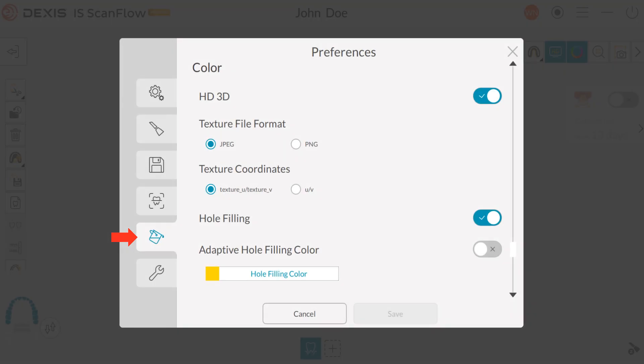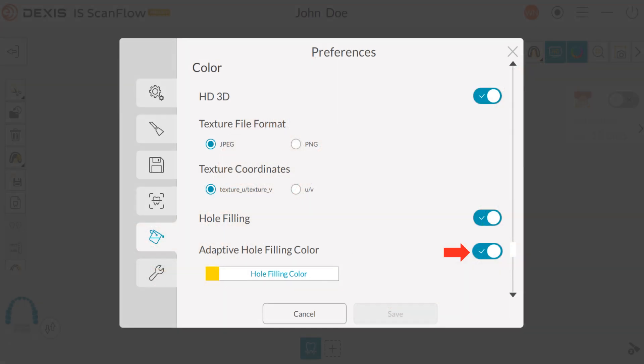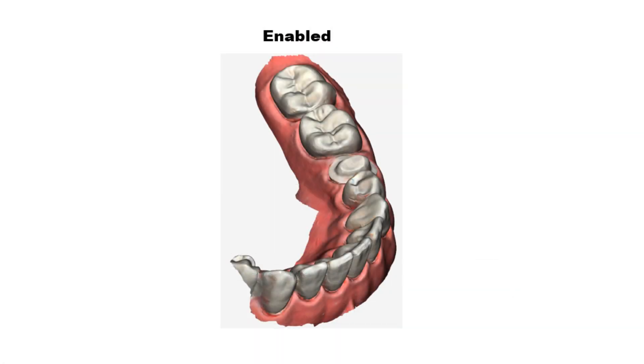Under the Color tab: Hole Filling is routinely enabled — the software manufactures data to fill in holes in the scan after refinement, and the color displayed is based on the hole filling color selection. To change the hole filling color, click Hole Filling Color and select the desired color, then click OK to save. Note: the adaptive hole filling option is only available when Enable HD3D and Enable Hole Filling are both selected.